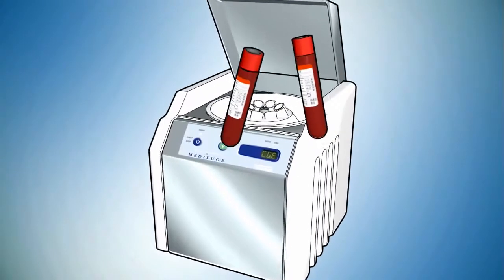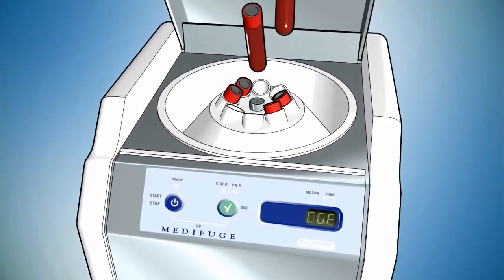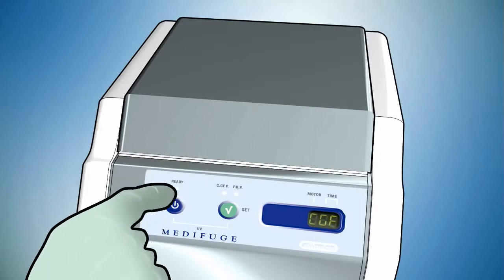Place tubes in pairs on opposite sides of the rotor to allow balancing. Close the cover, set protocol CGF, and press start.